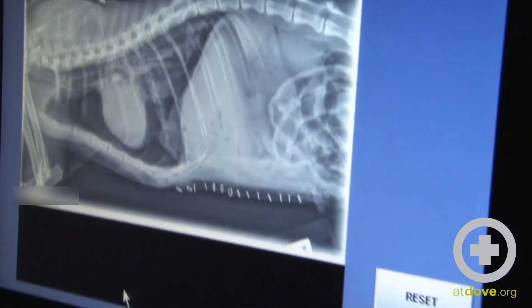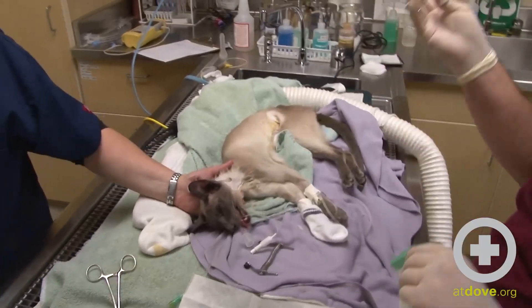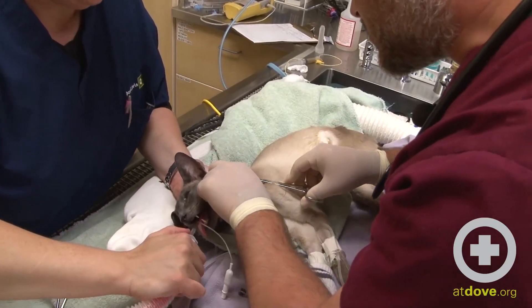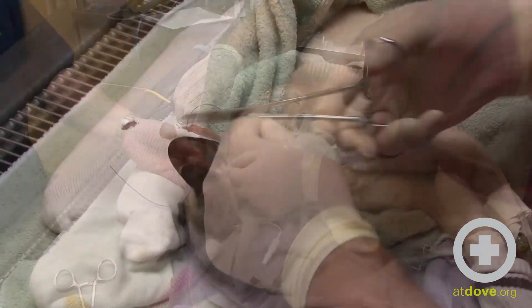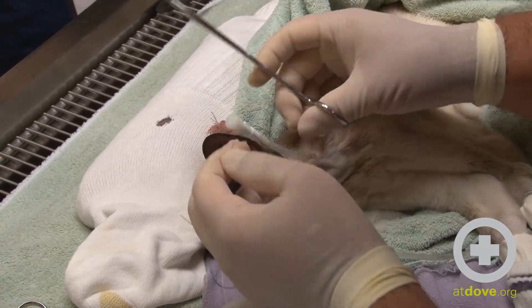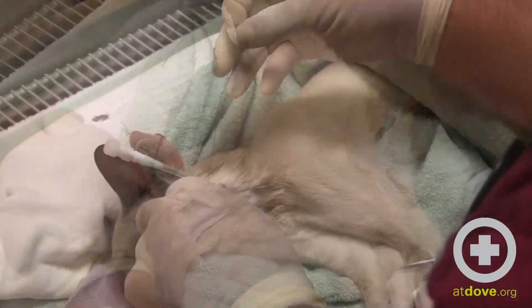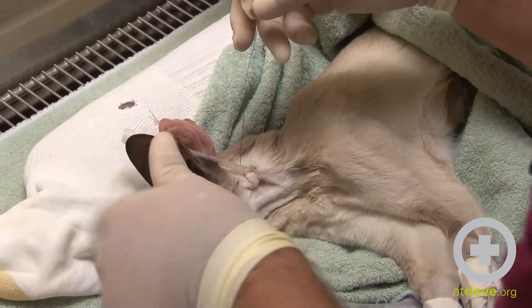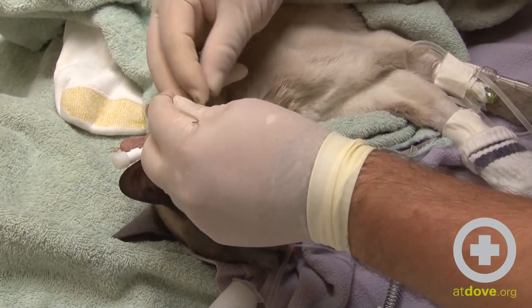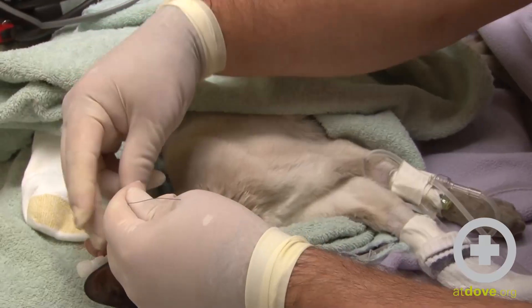You can see on the cat it has a pretty good pneumothorax from after the surgery, so the cat will require a thoracocentesis as well. Now that we have the correct positioning, we're going to do a Chinese finger trap suture pattern around the tube to secure it into place. First we anchor down the suture by tacking it to the skin, then proceed with the Chinese finger trap pattern. Once you have about three or four runs up the e-tube, that's enough — finish it off with several throws on the final knot and keep the suture nice and tight.